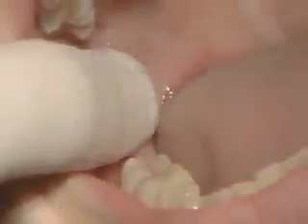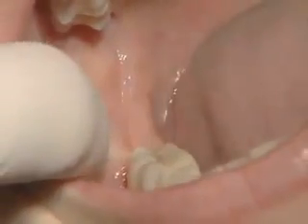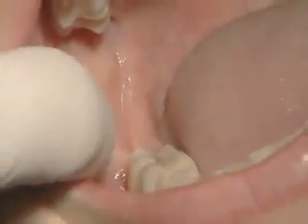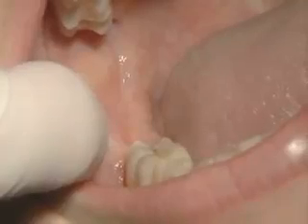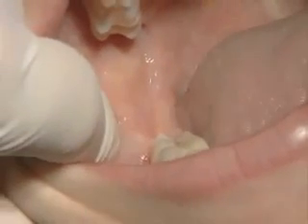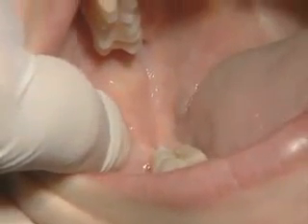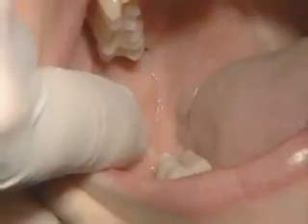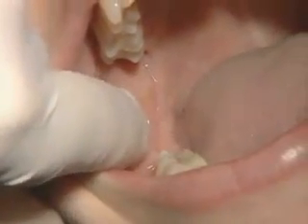The patient needs to open her mouth wide. The first point that is palpated is the anterior border of the ramus, and specifically the coronoid notch of the external oblique ridge — that is where my finger is resting right now. You then should move your finger in medially to feel the internal oblique ridge.